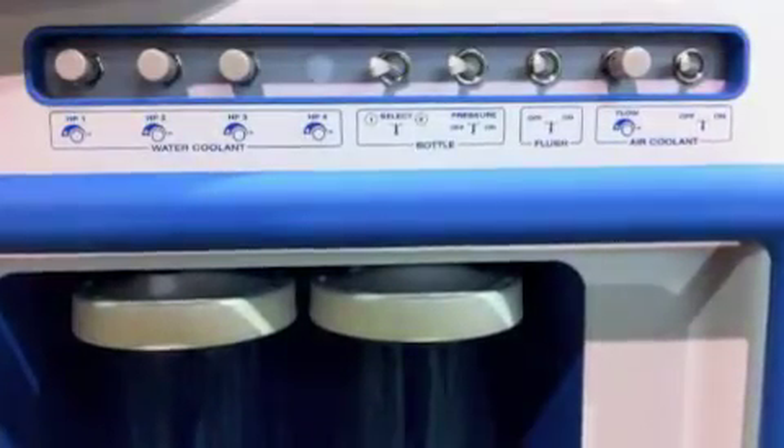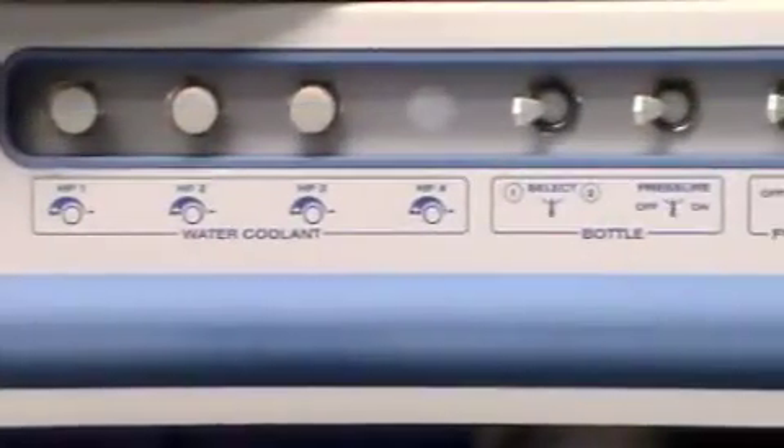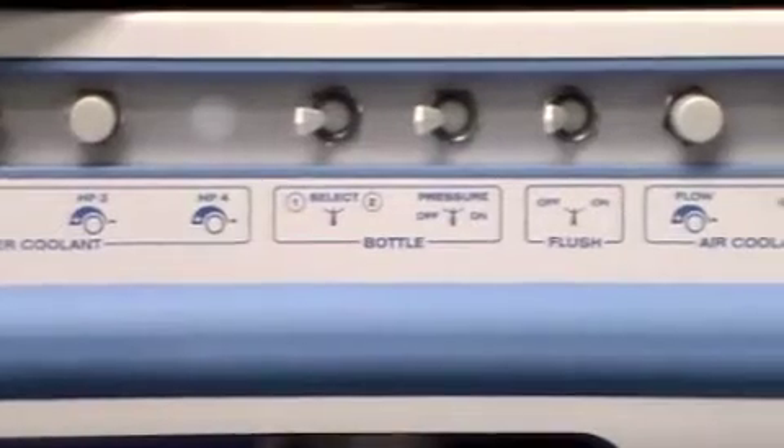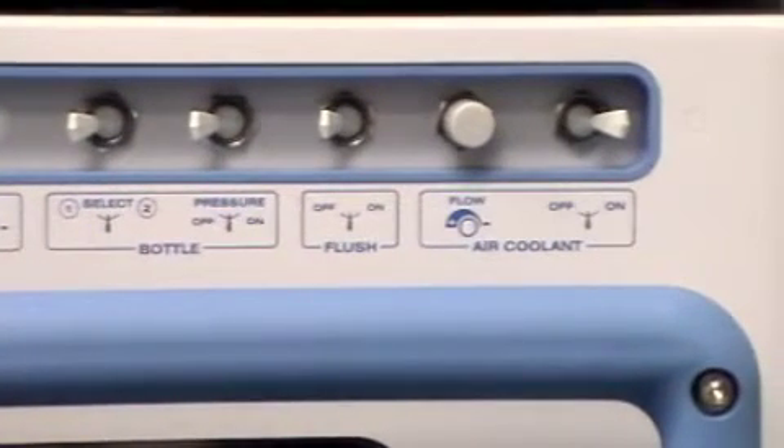Additional adjustments are located just above the twin water reservoirs. These include individual irrigation settings to each handpiece, water bottle selection and pressure, handpiece flush, and handpiece coolant air.